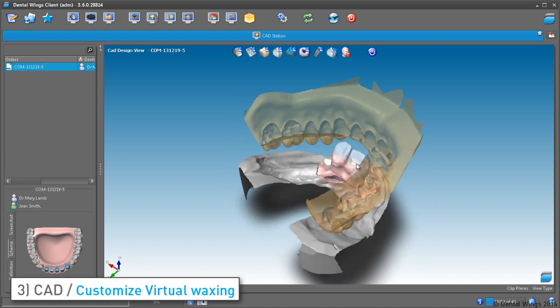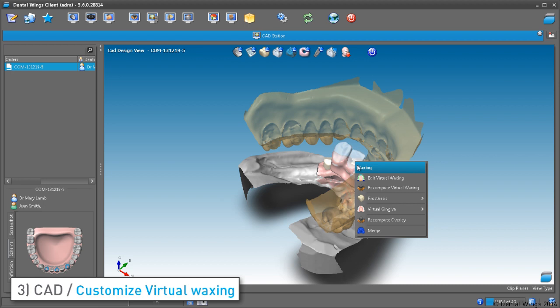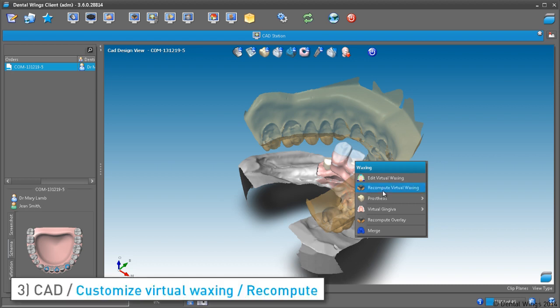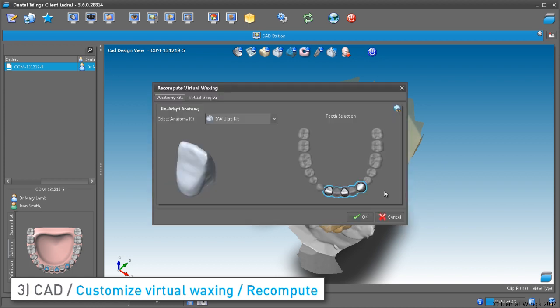If you wish to turn it into a full arch, nothing's easier — just right-click and select Recompute Virtual Waxing. To expand the bridge, just left-click and drag over the teeth to include. The expansion is then highlighted in blue.